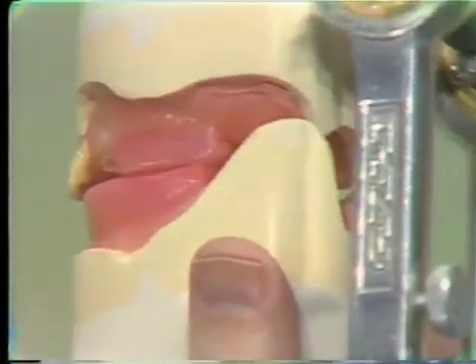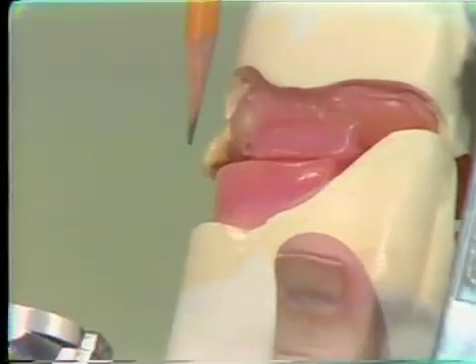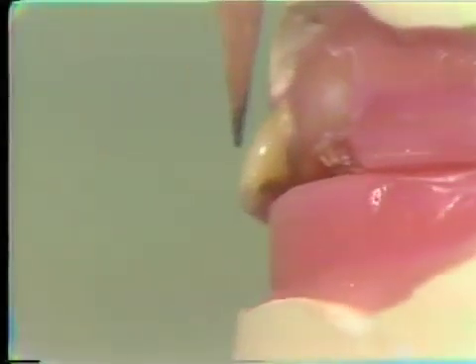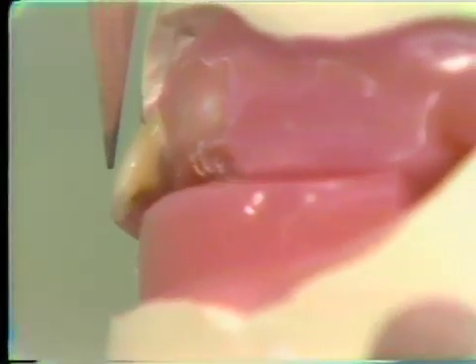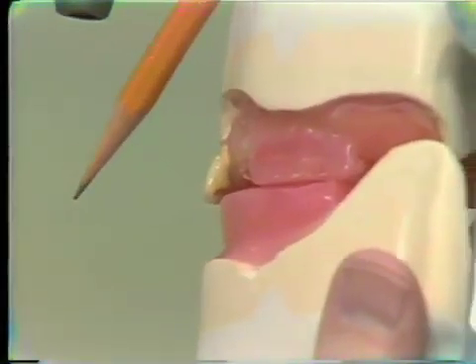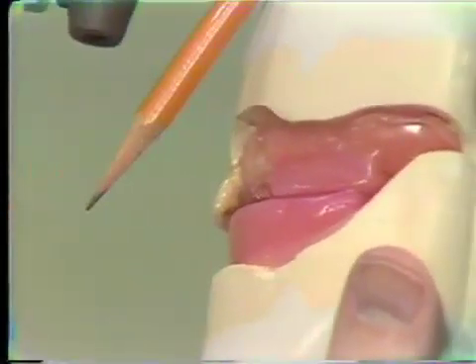One other thing I'd like to point out, and I might be a little bit to the labial, but it's close, I think. You'll notice on the tooth that you have, there's a flat portion forming part of the incisal face of the tooth. This should be in the vertical direction when the tooth is set. In other words, these teeth do not have a sharp labial inclination such as my pencil is in right now.